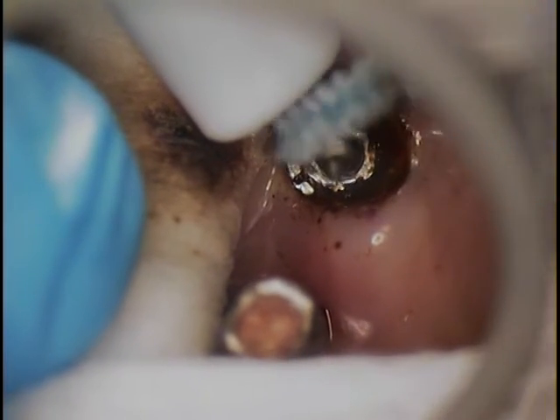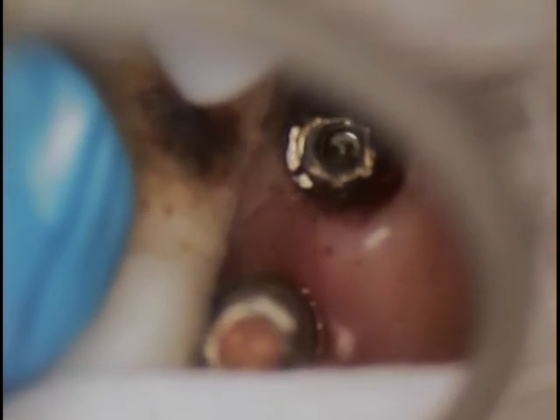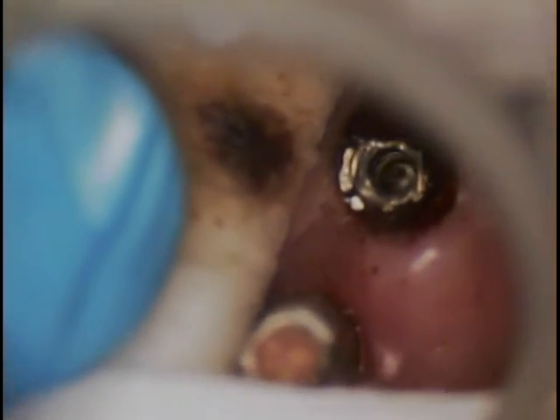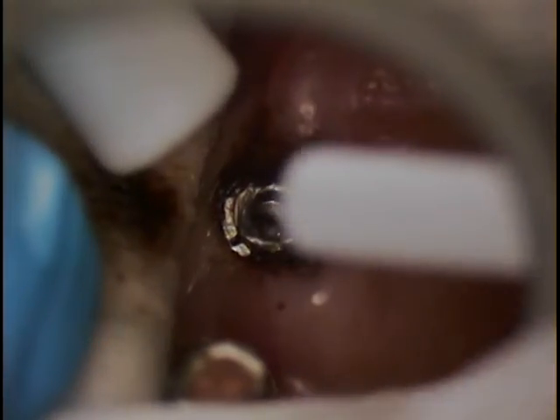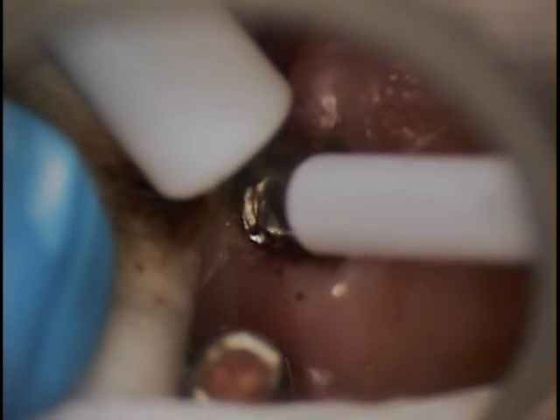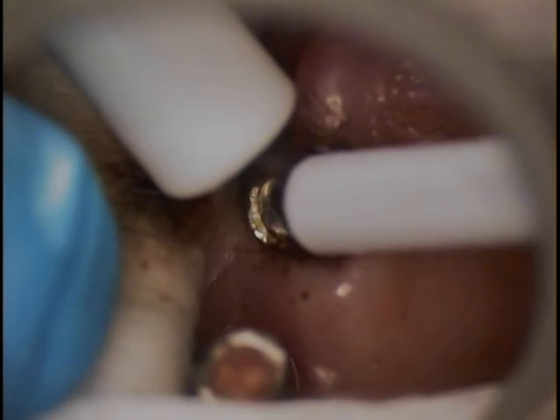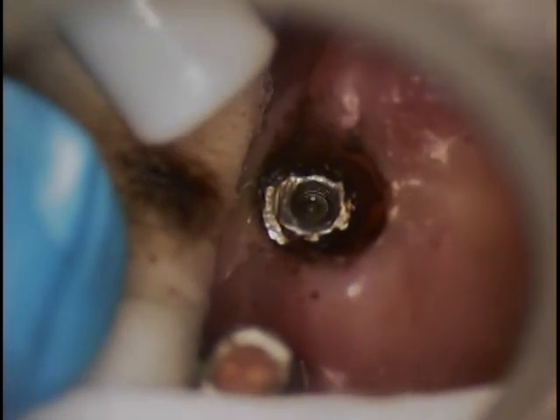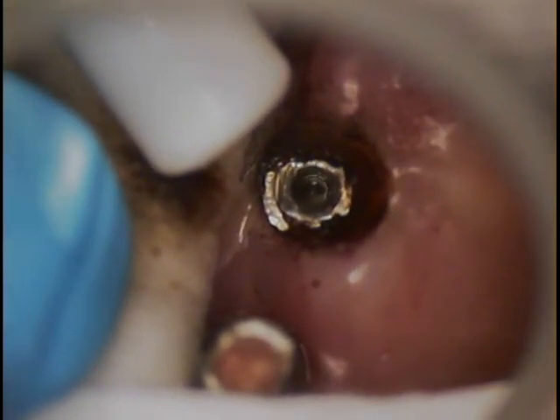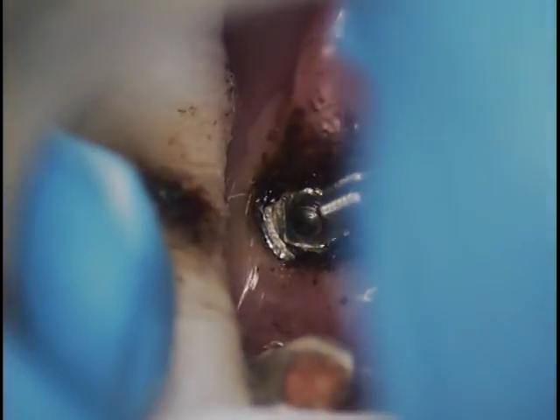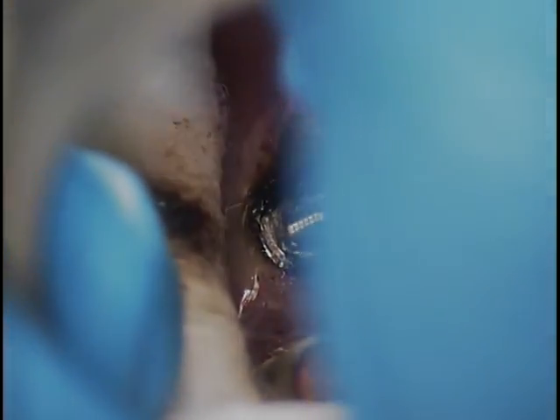We'll give it another try. I'll rinse that out. I'm going to leave the water in there as a lubricant.